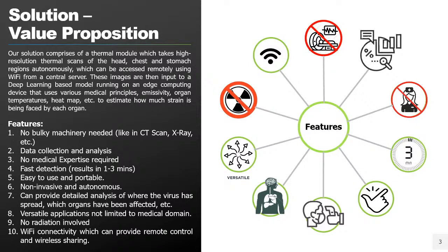Approximately 2 meters distance is required. There is no person that needs to operate the camera. It can be remotely controlled by someone sitting in some other room. And as it involves passive scanning, there is no radiation involved. The device is taking only the IR radiation that comes from our body, from our skin.